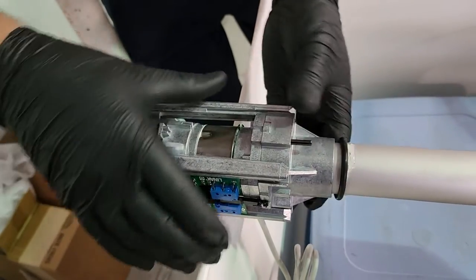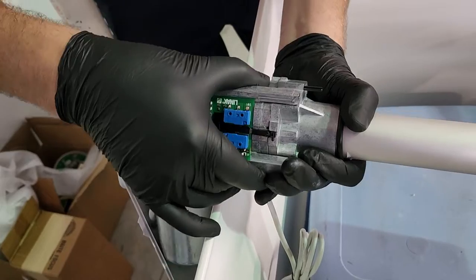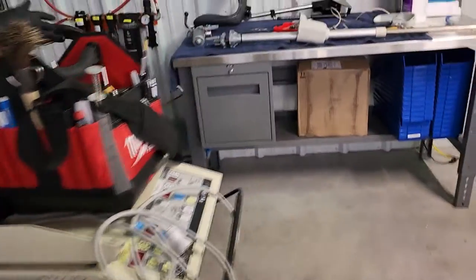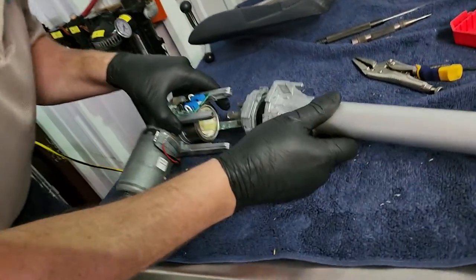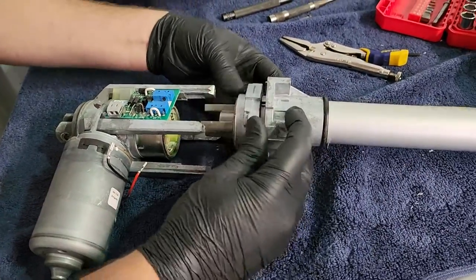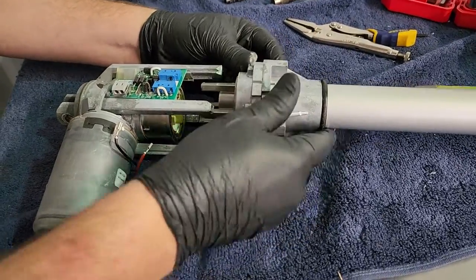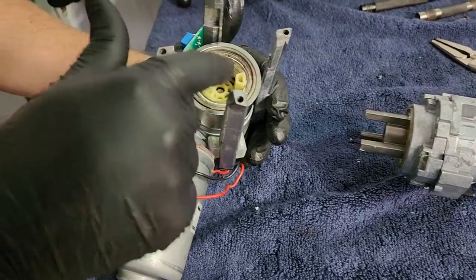Some roll pins are oriented in a very specific direction, so right now you can see how it wants to move. I'm not going to separate it yet. Let's take a look over here. The way these linear actuators are set up: there is a housing in the front, a middle piece like this — you can see how they rotate together — and then there's your rear housing, which is your motor.